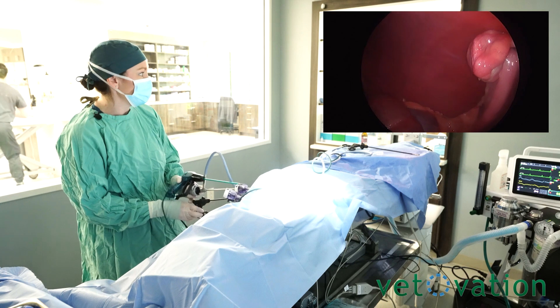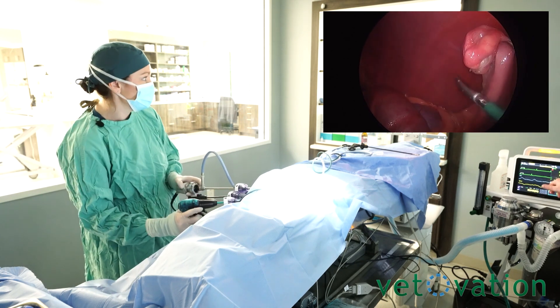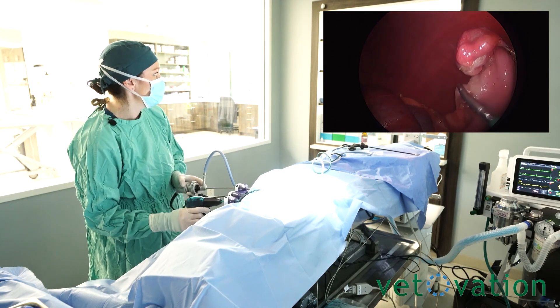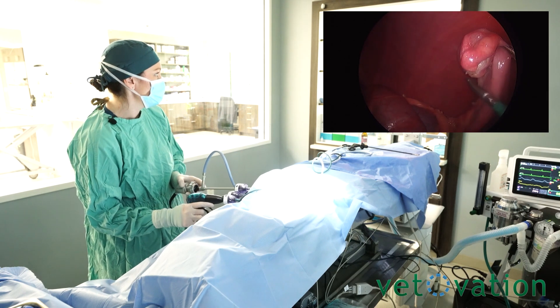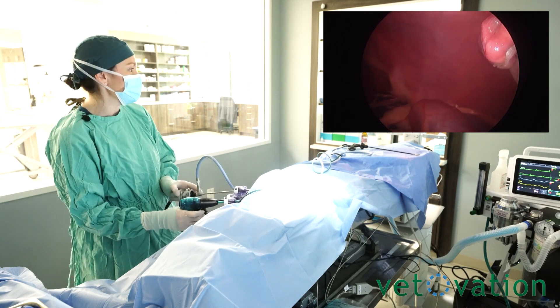Maybe one more bite — one more on that. Mango is 88 pounds, an 88-pound mastiff, roughly a year and eight months old. This is her month and a half after her first heat cycle.